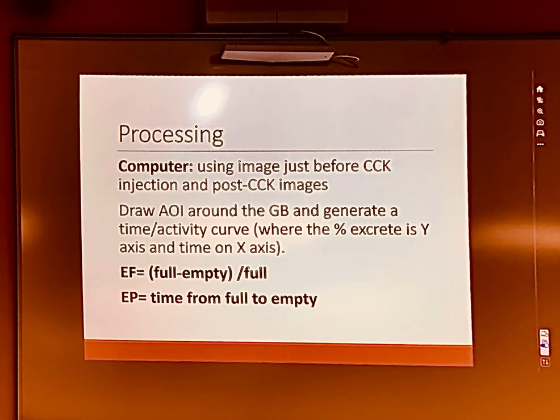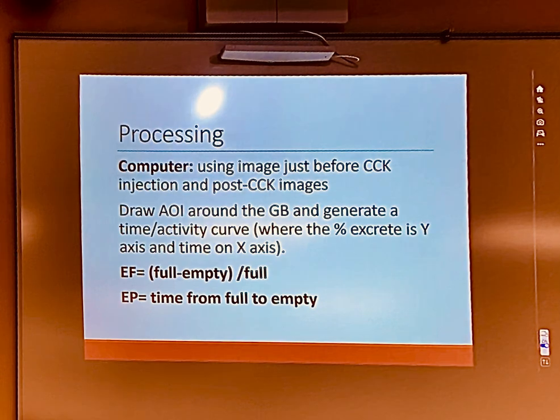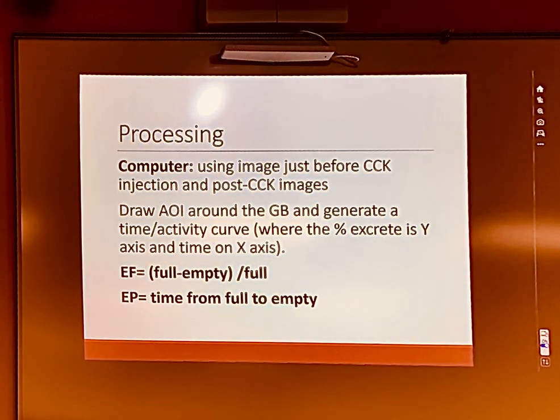So now you've got all the gallbladder in the region, all the gallbladder in the region, all the gallbladder in the region, and then your patient decides they're going to sneeze. Now your gallbladder's all the way down here and your region's up here. What do you think that does to your graph? Yep. So that is when you may need to say, I'm going to extract what I think is full, what I think is empty, and then manually do the math yourself. So you can always do that.